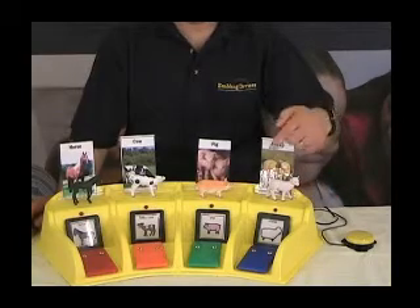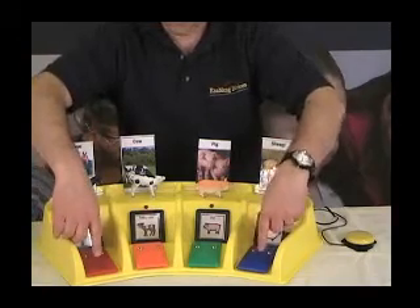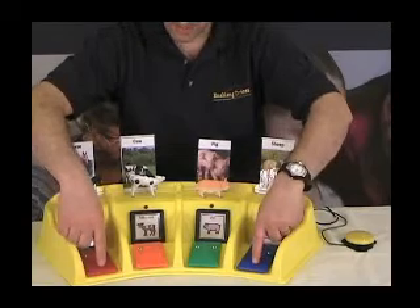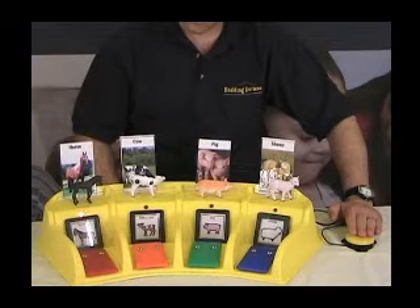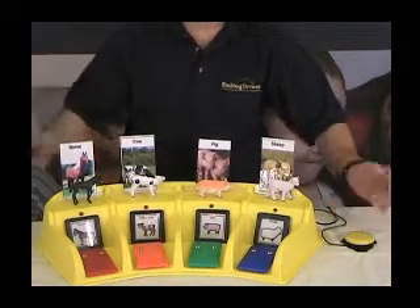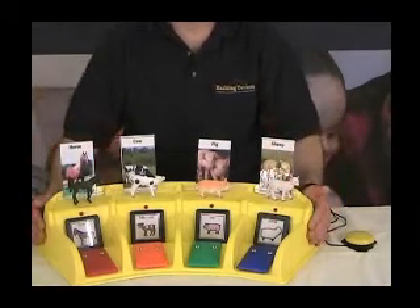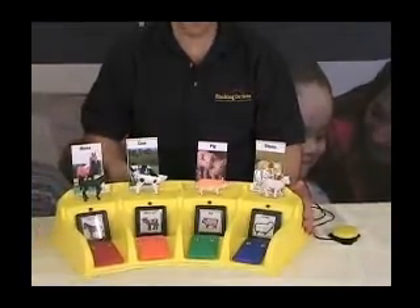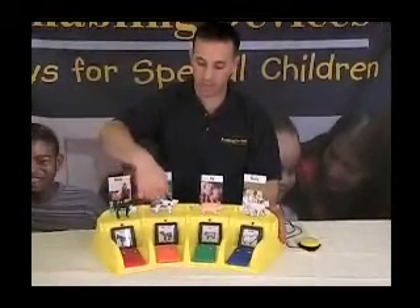The change from auto scan to inverse scan is very simple. Press cells 1 and 4 simultaneously, and the machine will give you a beep to indicate the change has been made. Now it should be in inverse scan — demonstrated with icons playing back messages. To switch back to auto scan, just press cells 1 and 4 again. There's also a scanning control knob on the bottom which adjusts the rate or speed at which the scan light moves past the icons.